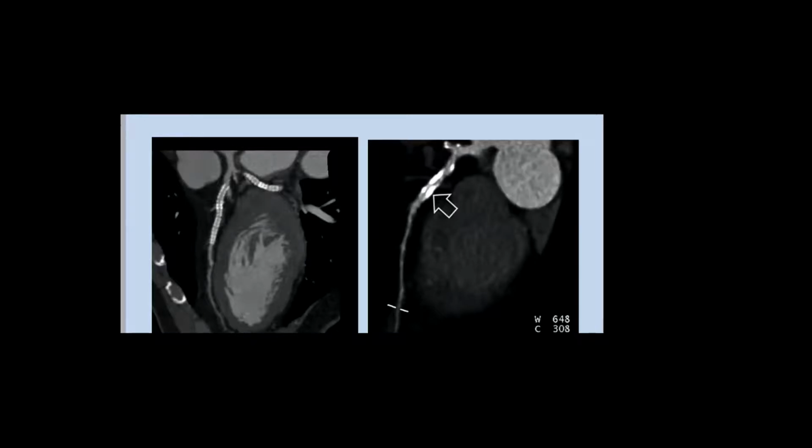That's why if a stent is more than 3 millimeters, it might still be feasible to image it with quite good accuracy in cardiac CT, but the smaller stents are not. So we have to be a little bit skeptical in imaging stents, and when we have a large amount of calcium in the coronaries. These are the two caveats or the two limitations of cardiac CT.